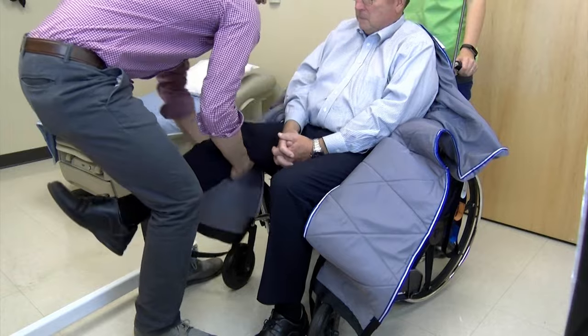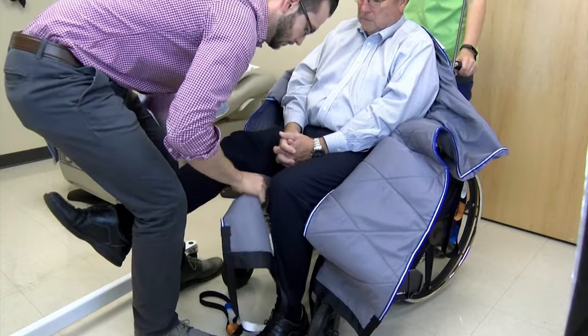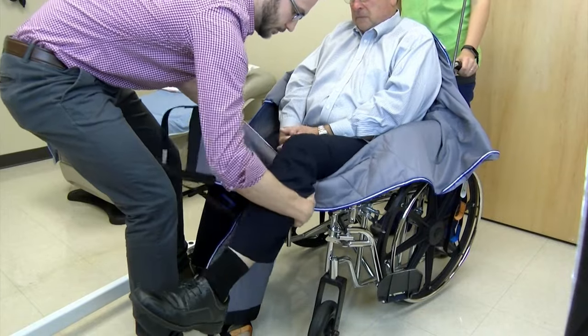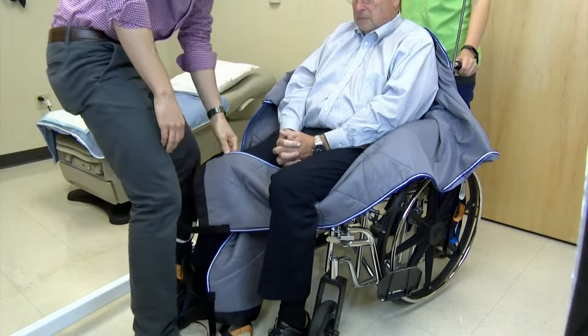Lift one of the patient's legs and pull one edge of the sling under the patient's leg just behind the knee. Do the same with the other leg. You will want to criss-cross the straps when attaching the sling to the Hoyer.